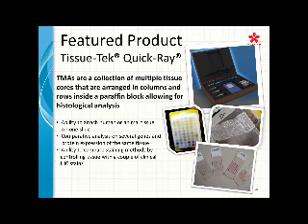And I know that most of us have control tissue stored in formalin, including myself, and at my lab we do the same. I highly recommend anytime you go to put a new control into place, you have to test it first because there's a very high possibility that that epitope will not be retrieved for that antibody.